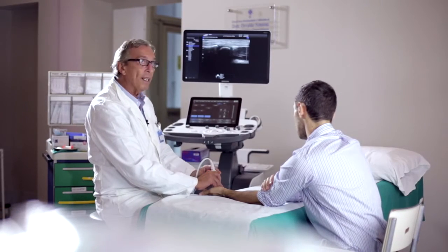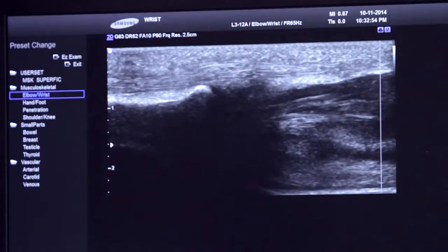This is an example of a scan dedicated to the superficial and deep flexors of the fingers, in this case, the third digit. We can see how the finger flexing and stretching clearly shows the movements of the two tendons along their tendon sheath.